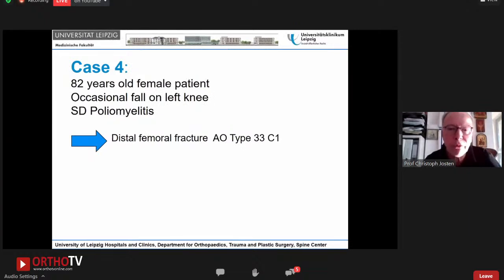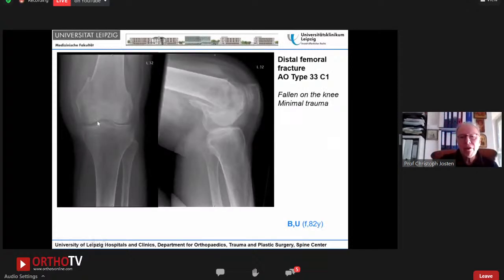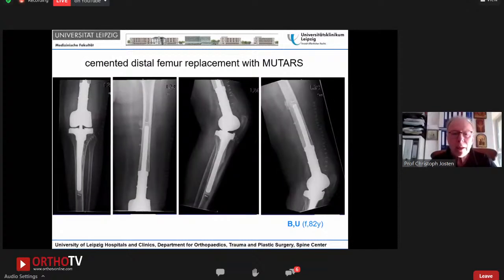This is an 82-year-old with a femur fracture, a C1 type fracture. And again, you see a very distal fracture. Of course, you can use a plate to fix this fracture, and you can make also an additional plate osteosynthesis in this very thin cortex of this 82-year-old lady. But according to my opinion, this is a better solution. Whether you need such a big shape of prosthesis is another question, but the patient can make weight bearing at once. It's stable. You have less pain than with osteosynthesis, and it makes it easier for the patient.